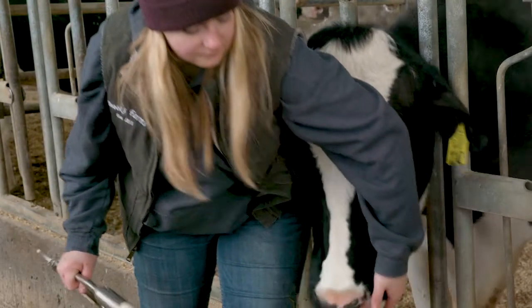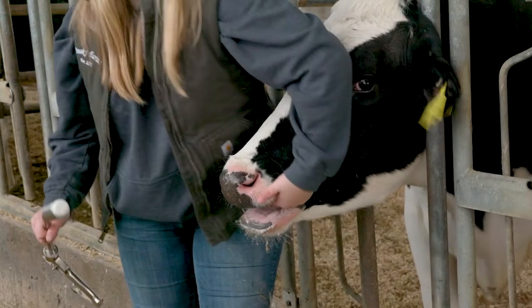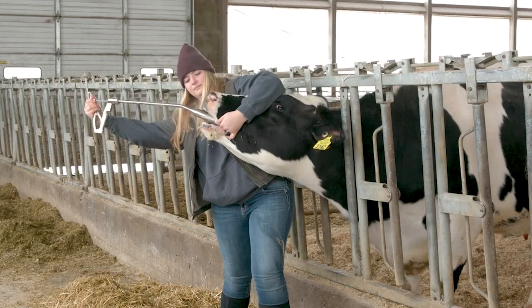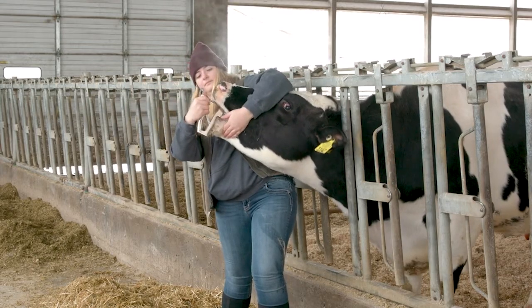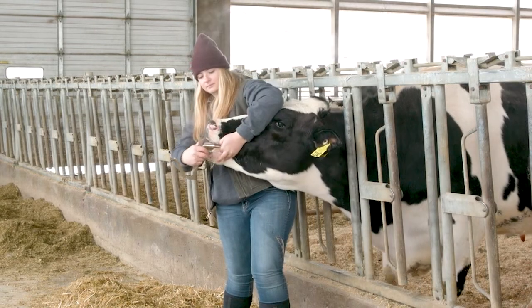Hold the cow's upper jaw. Fold her cheek gently under your fingers. Insert the loaded applicator into the cow's mouth. When you feel resistance, gently guide the applicator over the tongue.